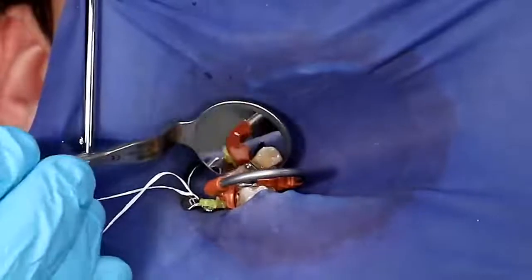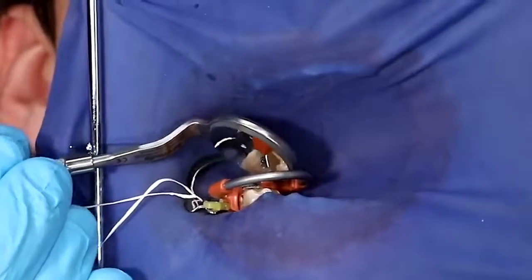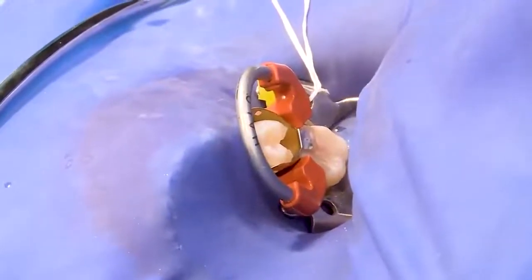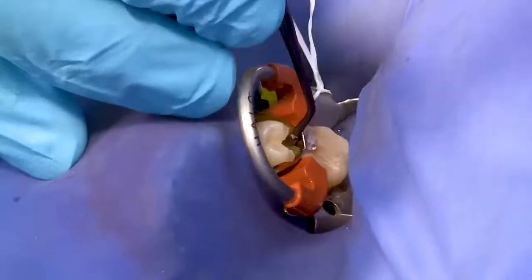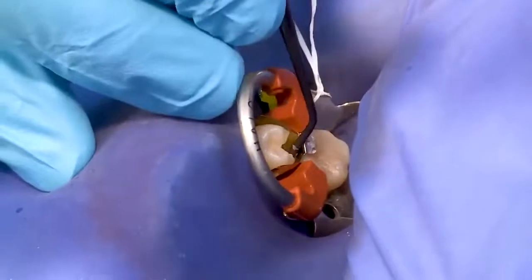Inspect matrix, wedge, and ring placement to ensure that matrix is well adapted to the cavo surface margins, and that matrix is in intimate contact with the adjacent tooth. Please note, burnish the sectional matrix only if it's necessary to maintain the original contour of the matrix.